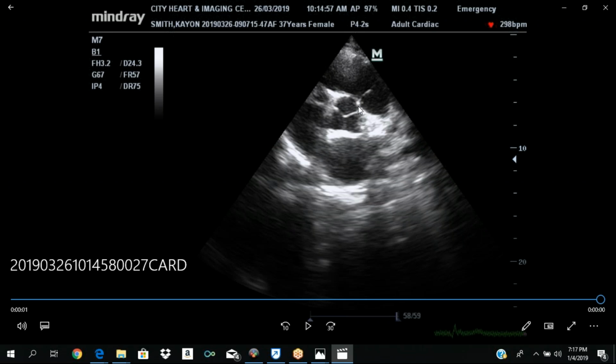Okay, so you can see when the aortic valve closed, this is a closed aortic valve. It has this Mercedes-Benz configuration. So this is the aorta with the aortic valve inside. Your tricuspid valve is right here. This is the right ventricle. Right ventricular inflow tract is right there. Right ventricular outflow tract is right over here. Okay. Tricuspid valve. Your pulmonic valve is right there.